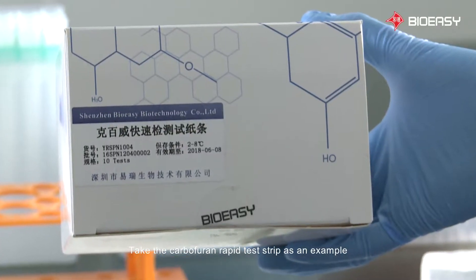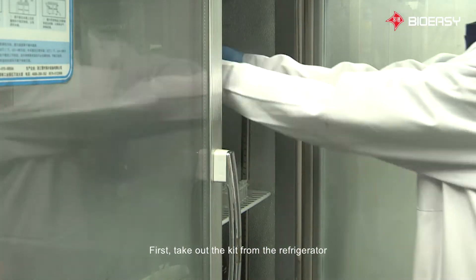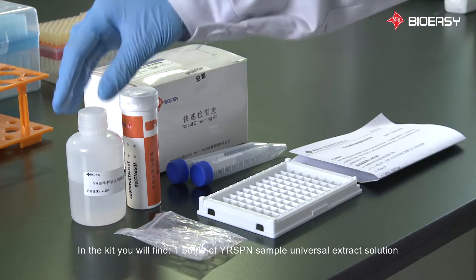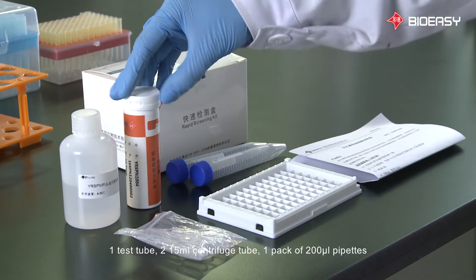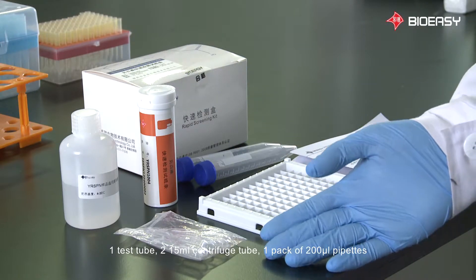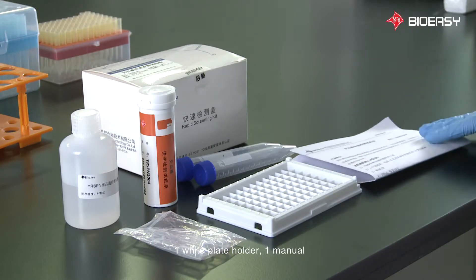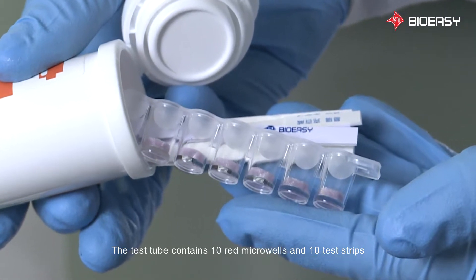Take the Carbofuran Rapid Test Strip as an example. First, take out the kit from the refrigerator. In the kit, you will find one bottle of YR-SPN Sample Universal Extract Solution, one test tube, two 15-milliliter centrifuge tubes, one pack of 200-microliter pipettes, one white plate holder, and one manual. The test tube contains 10 red microwells and 10 test strips.